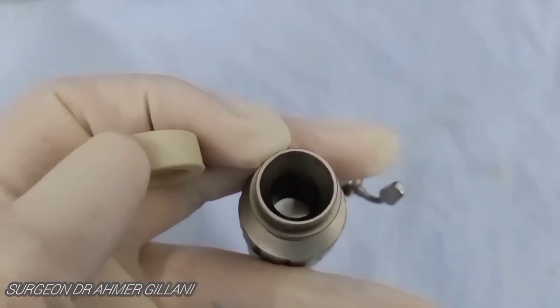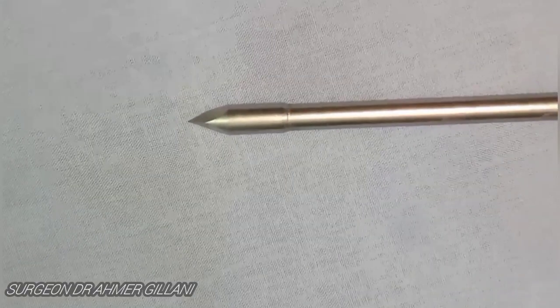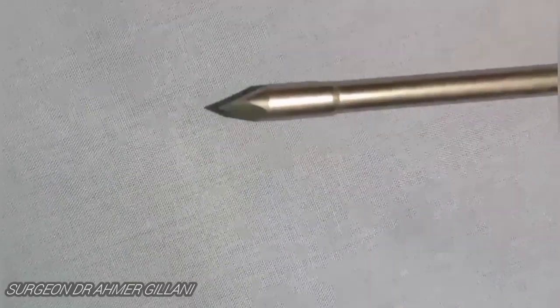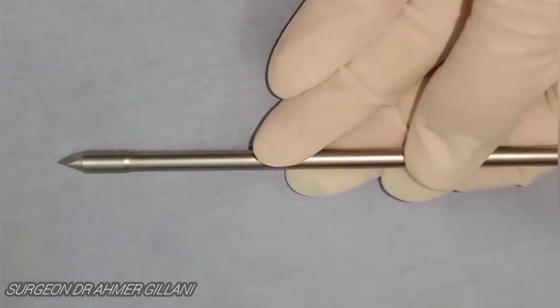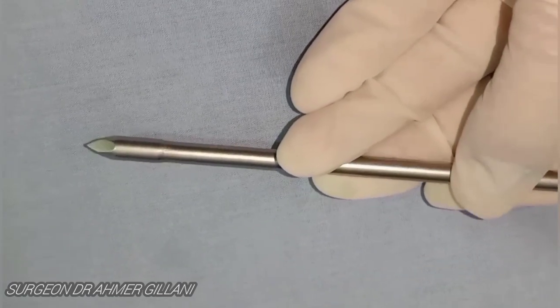When the trocar and cannula combine, it becomes the laparoscopic port from which you will insert the instruments. In the zoomed-out and upward view you can clearly see the trocar on the screen. There are various types of trocar — they may be blunt or sharp and of different sizes, used for various purposes.